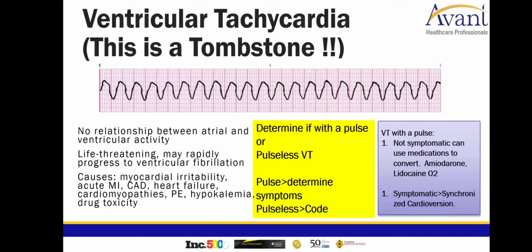Now, you've heard me mention synchronized cardioversion. What basically does that mean? It means that you're going to synchronize your electrical activity, that you're going to create that shock with the heart itself, because you don't want to shock the heart and for that shock to land on a vulnerable area of the heart, mainly around the T wave. If you land on the T wave, that can cause more damage and more serious problems. You want to avoid landing on that vulnerable area. So you want to synchronize your shock with the heart rhythm, and that's done through the defibrillator device. You push the synchronize button, okay?